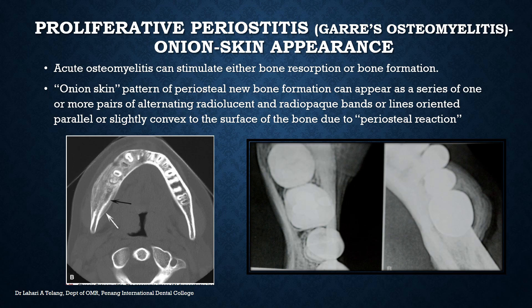Proliferative periostitis, also referred to as Garré's osteomyelitis, has an onion skin-like appearance. This is acute osteomyelitis that can stimulate either bone resorption or bone formation. The onion skin pattern of periosteal new bone formation appears as a series of alternating radiolucent and radiopaque bands or lines oriented parallel or slightly convex to the bone surface due to a periosteal reaction. You can see layers of radiolucency and radiopacity on both the CT image and the plain radiographic image, resembling an onion skin. This is generally seen in younger individuals.